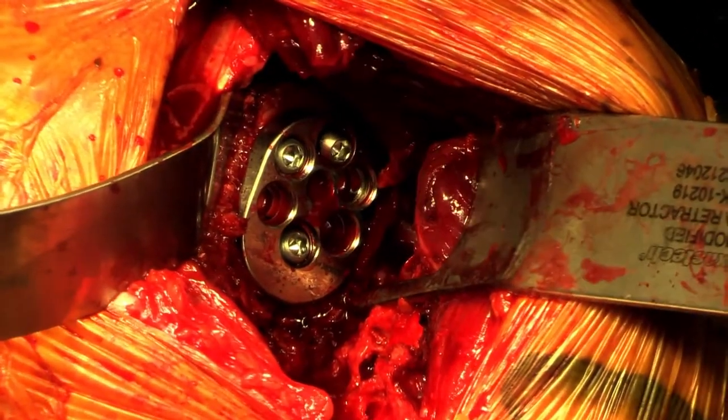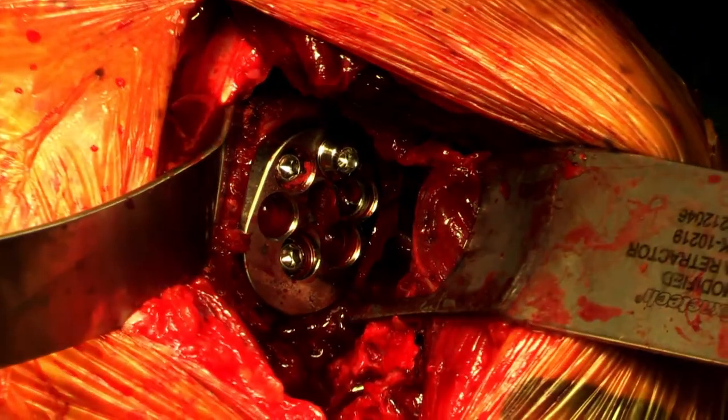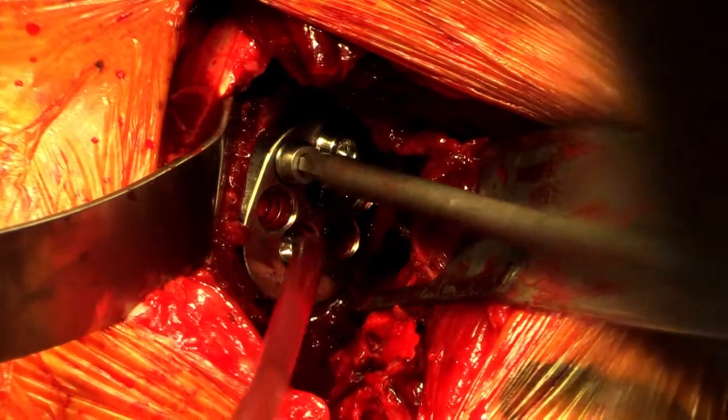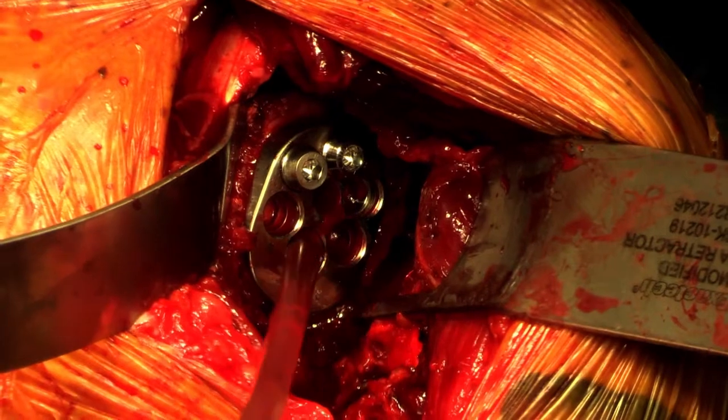Now, place your screws and tighten by hand. Apply locking caps. Note, all screws are variable axis up to 30 degrees, and all screws are compression screws with locking caps.